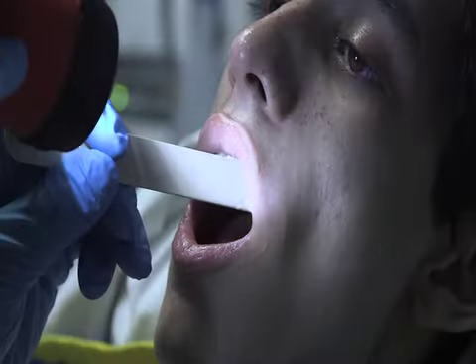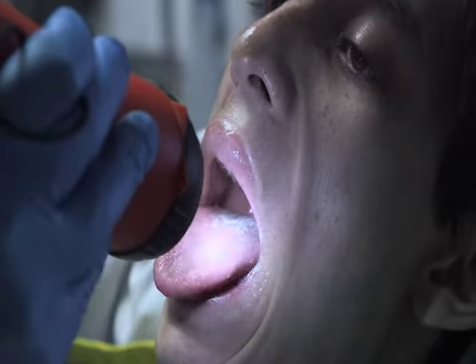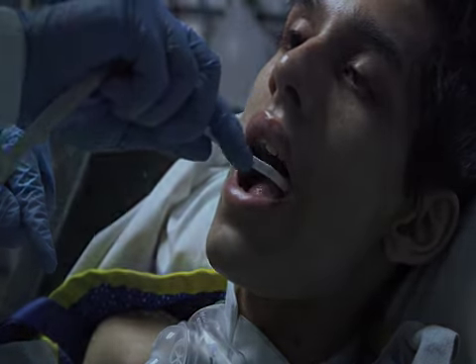In this video, we will discuss oral health changes that accompany mechanical ventilation in the critically ill, the 4 components of comprehensive oral care, and recommended oral care delivery techniques for the intensive care patient.